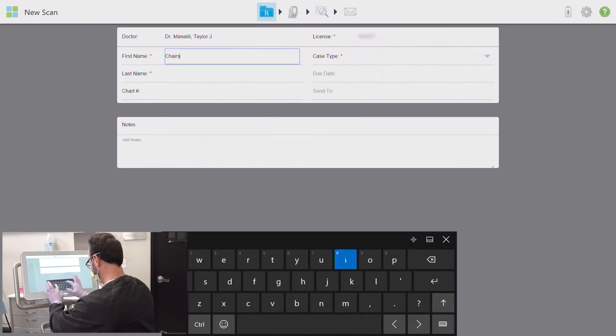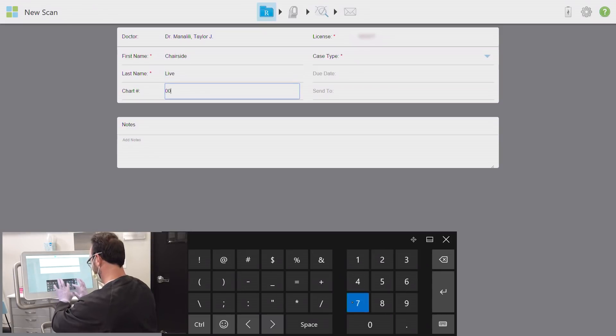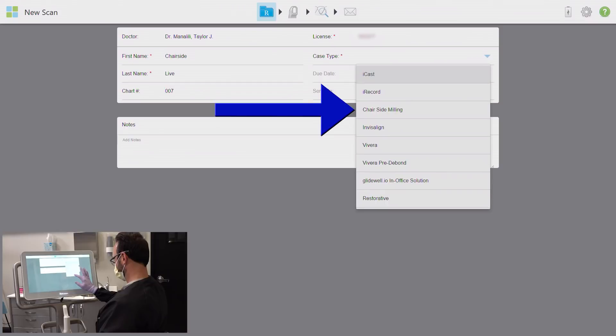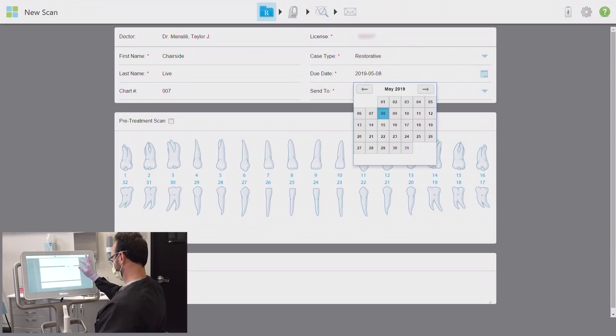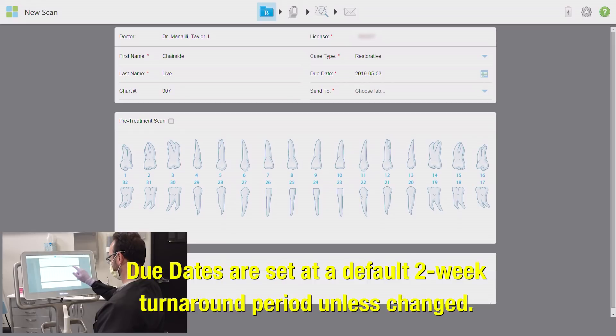I'm going to enter this patient's information quickly — I'll usually do this before my doctor actually prepares a patient so it's all ready to go when they are. If you are sending this case to your own chairside mill, select the chairside milling or gladwell.io in-office solution option under the case type menu. The due date for a chairside mill doesn't really apply, but it has to be entered. The menu won't allow you to select today's date even if you are in fact milling right now, so I simply select the next day.